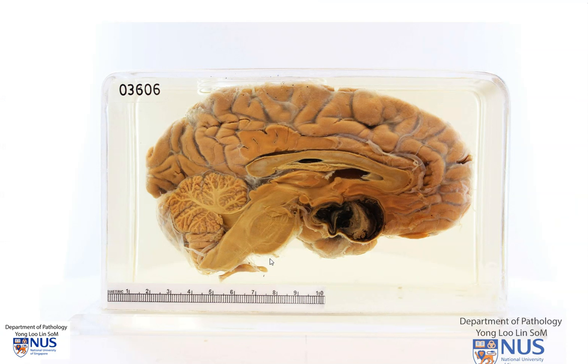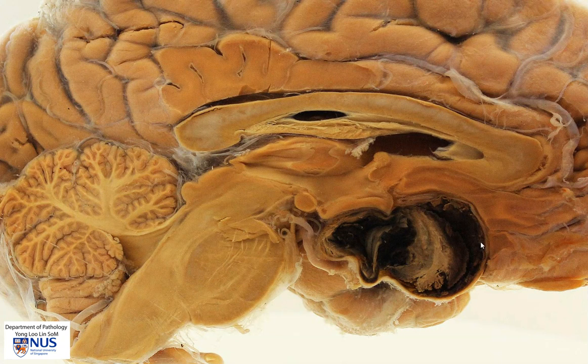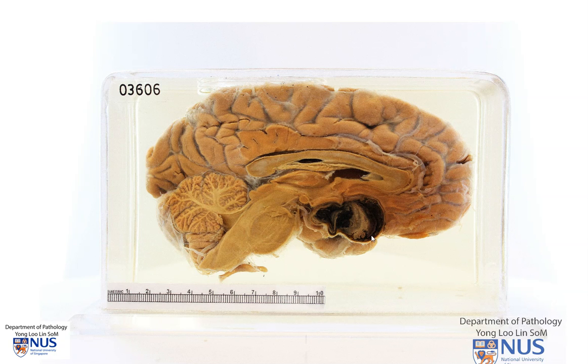In summary, we have here a sagittal section of the brain where the main pathology is in the region of the circle of Willis at the base of the brain. There is a berry aneurysm here with intraluminal thrombus with fibrin formation. One of the main complications of berry aneurysm is the possibility of rupture with subarachnoid hemorrhage and sometimes intracerebral hemorrhage.